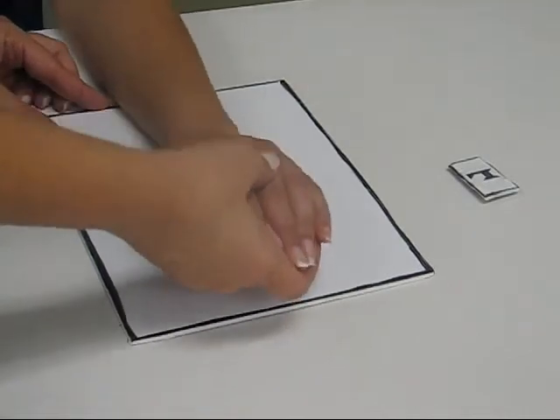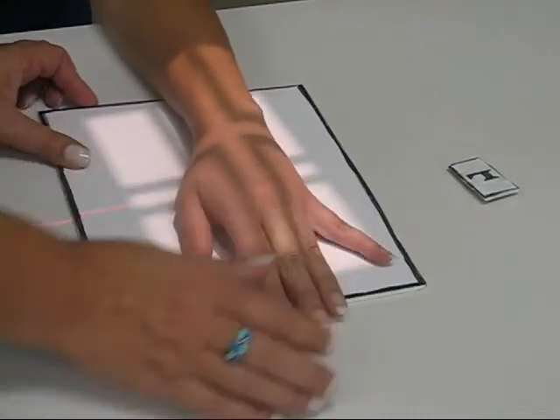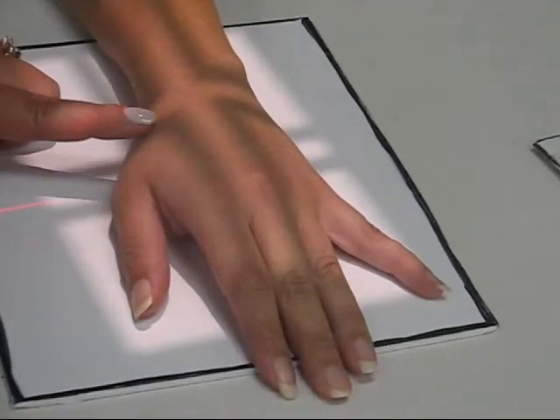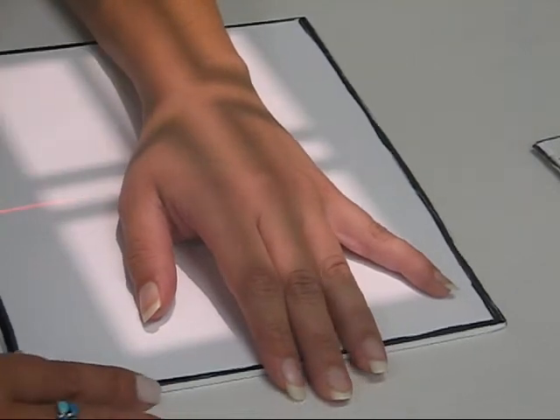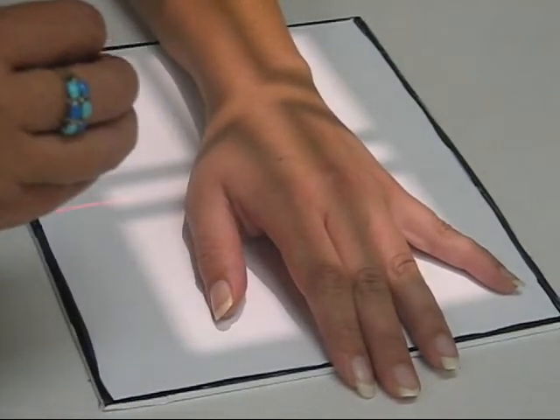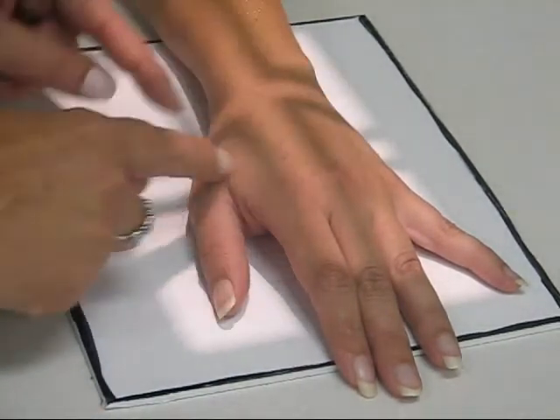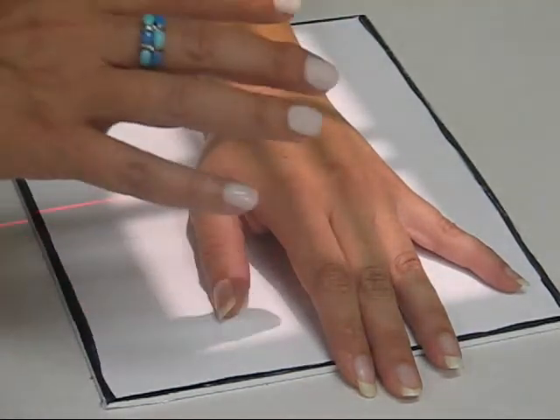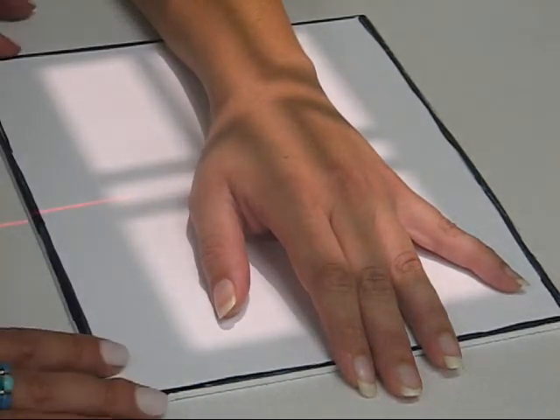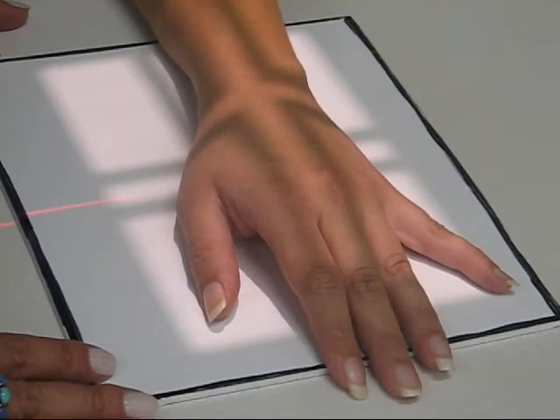There is a specialty view of the wrist that is very common. You're most likely going to encounter it and talk about it, called the navicular. Okay? The navicular is a bone right in here that very often gets broken. So a lot of times we need to see it, or the doctor needs to see it a little better visualized than other bones. And as you know, all the carpal bones here are almost on top of each other. It's kind of hard to distinguish them sometimes. So there's a view that we do called the navicular view that kind of isolates the navicular a little bit.